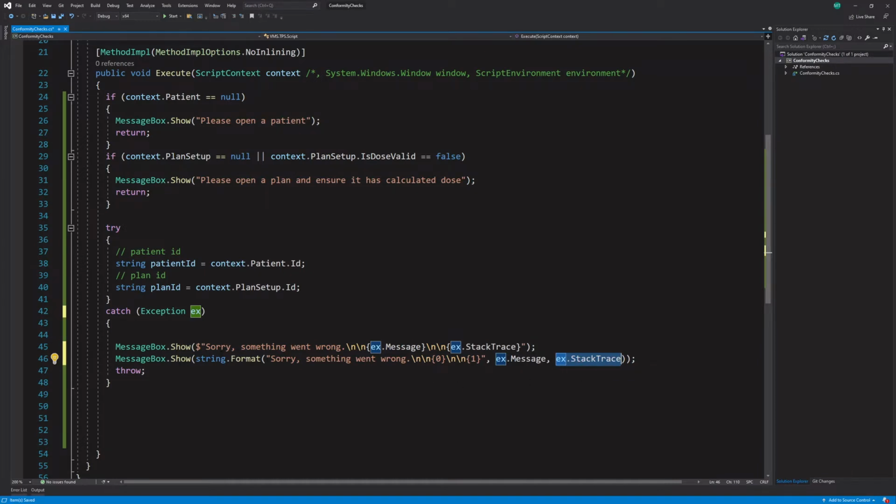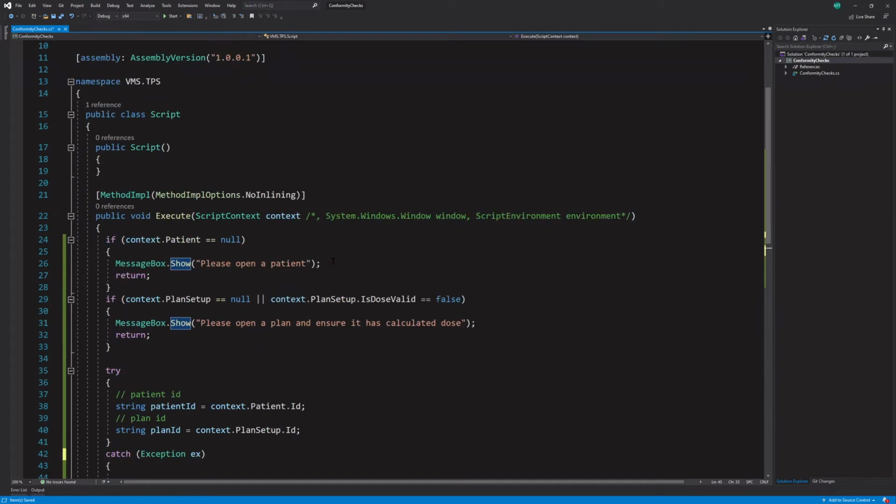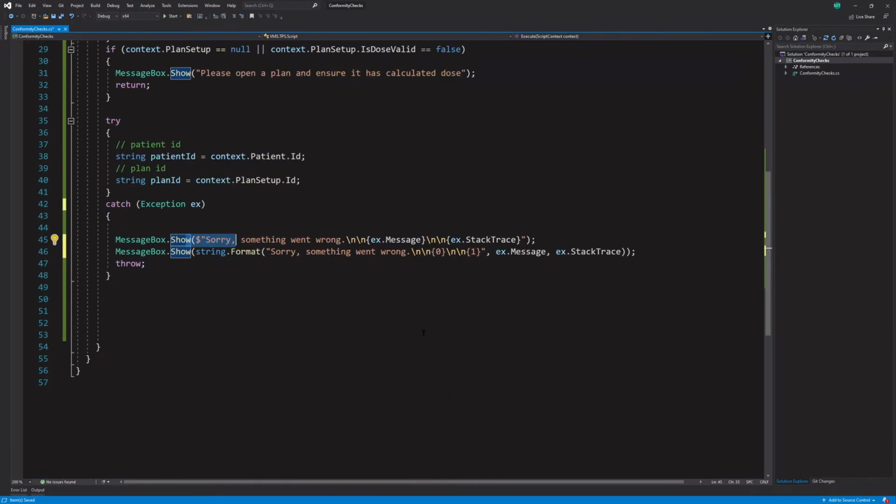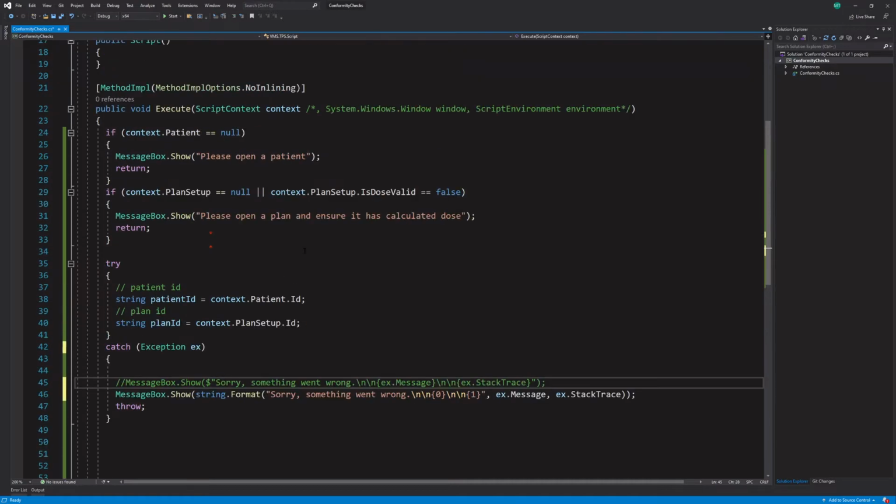So if for whatever reason you can't use, and actually, you know what? That's a good point. Because we're in a single file plugin, at least on my version, you can't even use string interpolation. So we actually have to use it. It doesn't recognize this $, right? So if we ran this script, we would see that that's what it would do. And let's just go ahead and test the script.